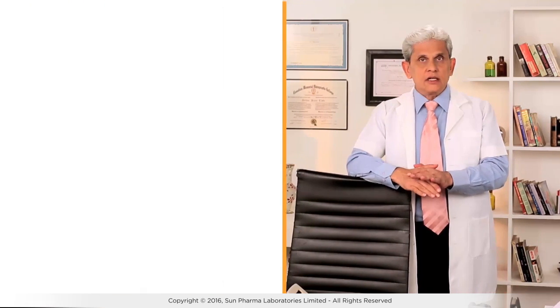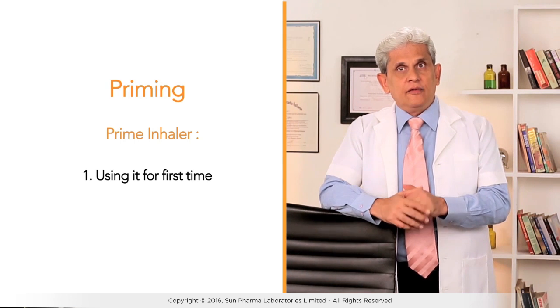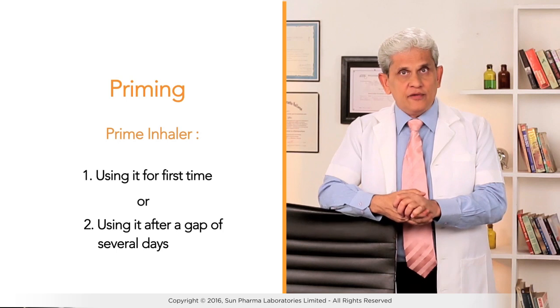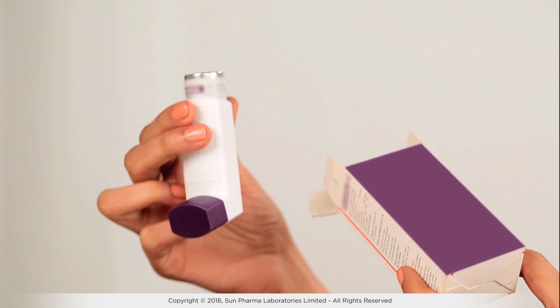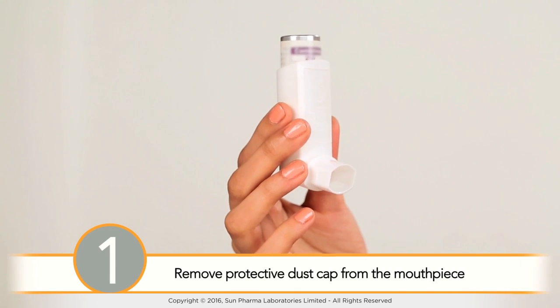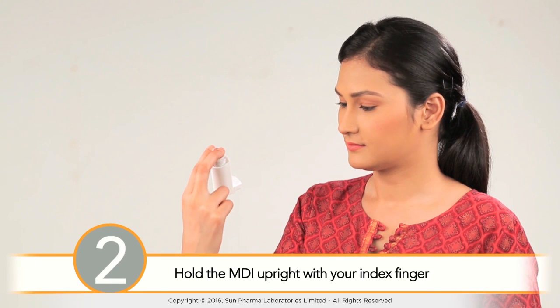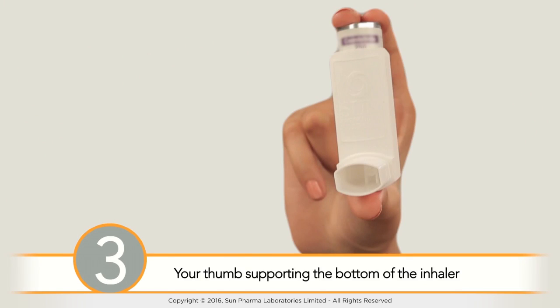Making the inhaler ready for use is called priming. You need to prime the inhaler before using it for the first time, or if you are using it after a gap of several days. To prime the inhaler, remove the device from its package and remove the protective dust cap from the mouthpiece. Hold the MDI upright with your index finger on the top of the medication canister and your thumb supporting the bottom of the inhaler.